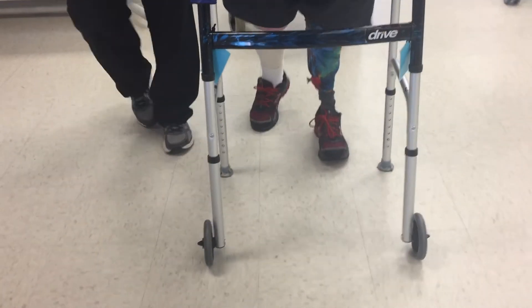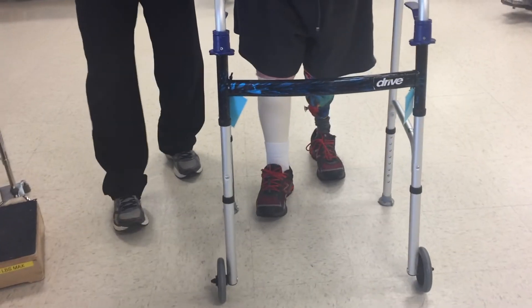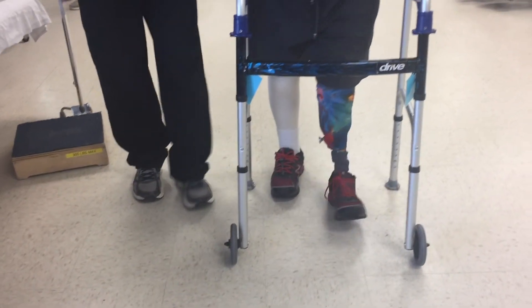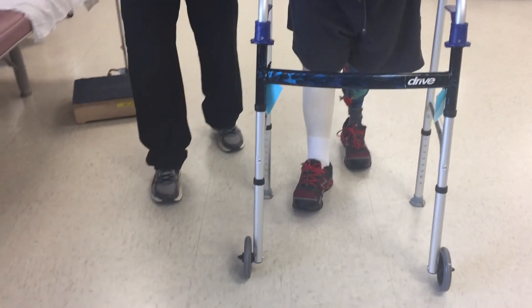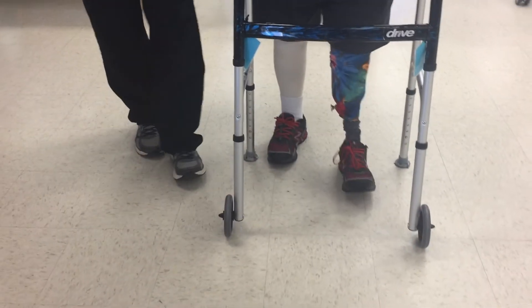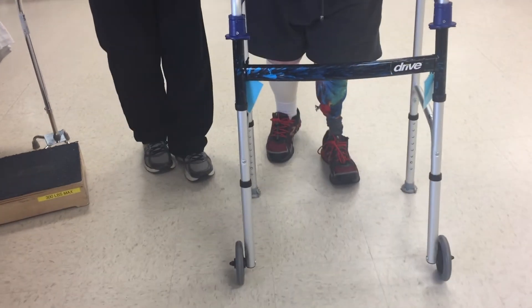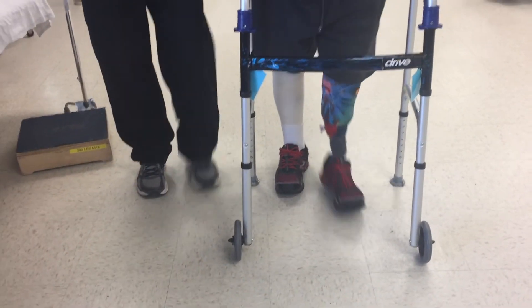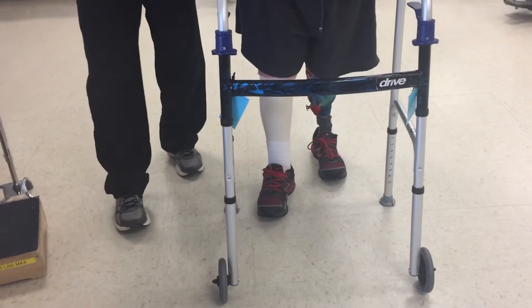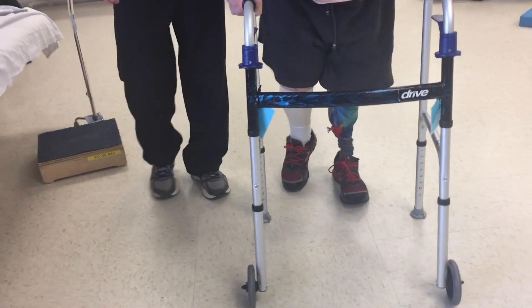Once the patient has their prosthesis and is ready to start ambulating, we bring them to the therapy gym and use parallel bars initially, then move them to a rolling walker once they're stable. This patient is now ambulating with her below knee prosthesis taking short steps, and we work on stride length as well as stride cadence. She's actually doing quite well for being this early in her prosthetic recovery period.